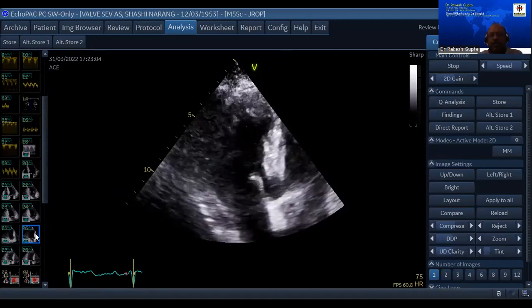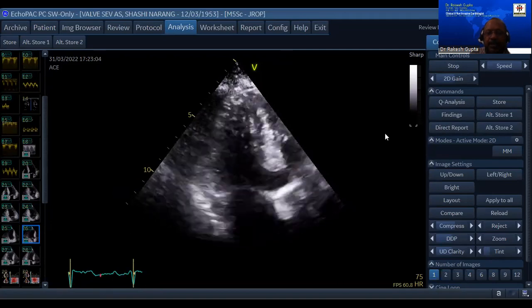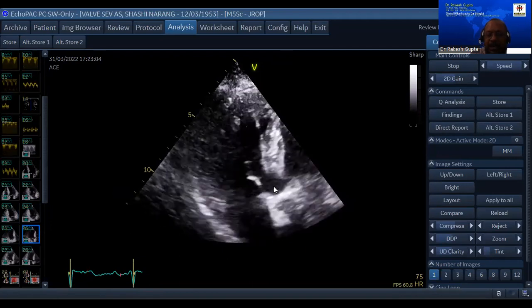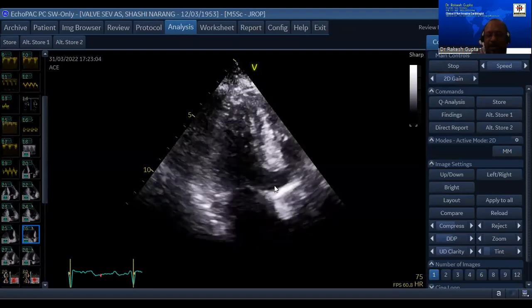All right. What's your name, dear? Jai Singh. Jai Singh, this is a 3-chamber view, right? Right, sir. So where will I keep my pulse wave? Just prior to my LVOT, just prior to the aortic valve. Here I'll keep my pulse wave.